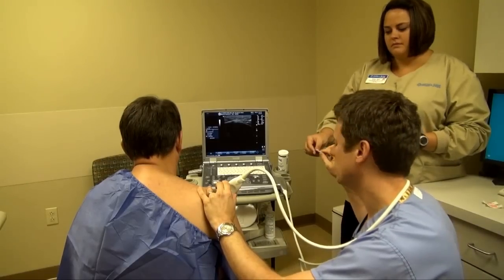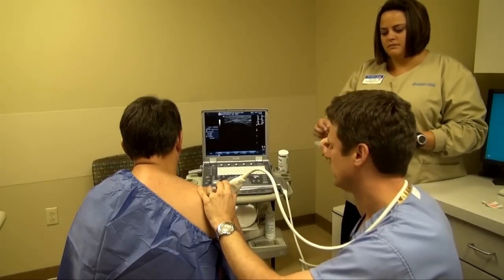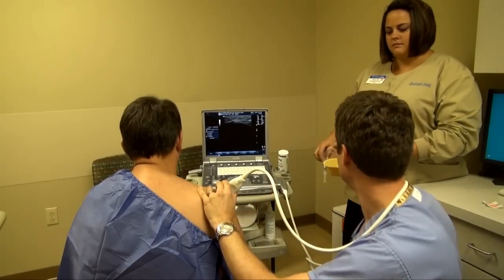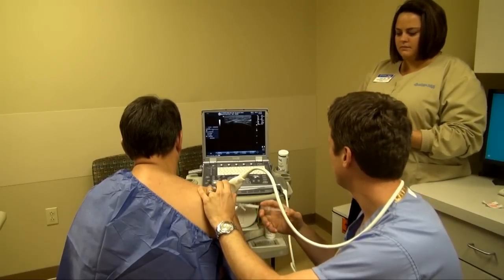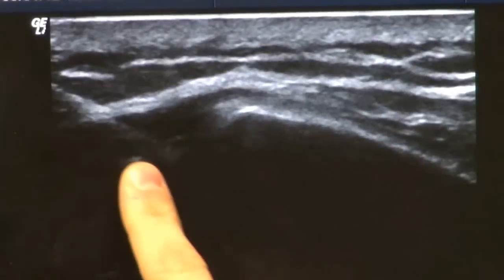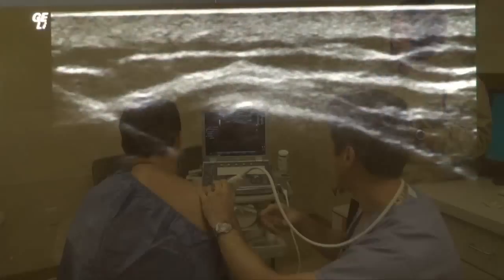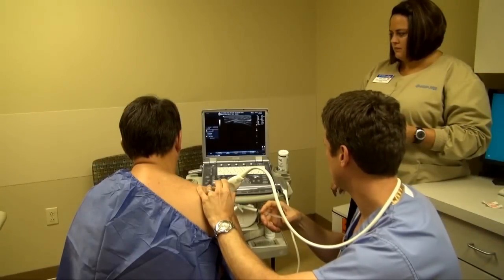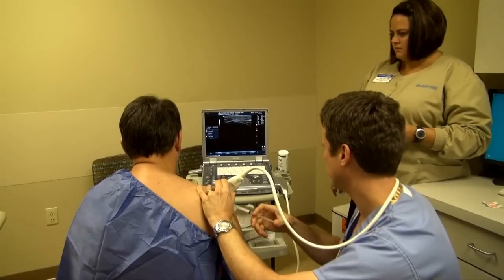You're going to feel a little bit of alcohol just to sterilize your skin in that area. You'll feel a little poke, it won't hurt. And then on the screen I can see the needle, it's right here. So I'm going to point that needle underneath that bone, and we're going to slowly advance it — you might feel some pressure.